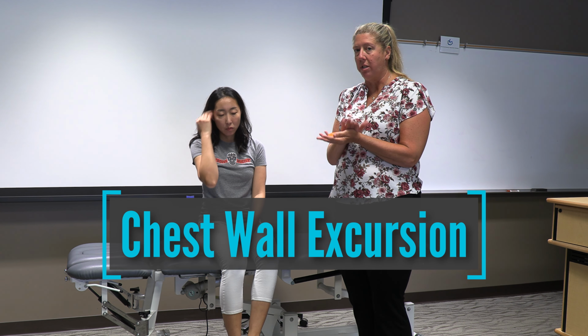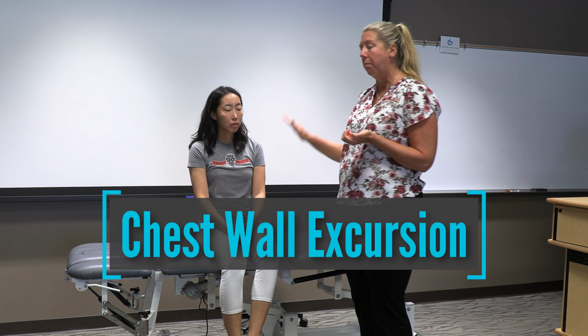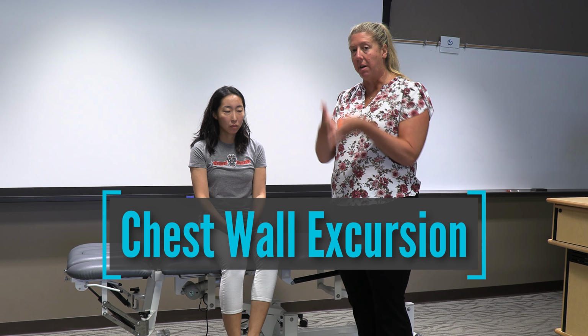Alrighty, so I am going to demonstrate how we measure chest wall excursion. Ideally, we want to do this over skin. So when you're coming into lab or you're in your lab practical, it's always good to ask if someone has a sports bra or a tank top on so that the cloth from the t-shirt isn't affecting your measurement. We don't have that today, so we're just going to make do with what we have. But again, in the practical, you want to go over skin or over tight clothing. And this is a pretty tight t-shirt, so we're probably going to be fine.